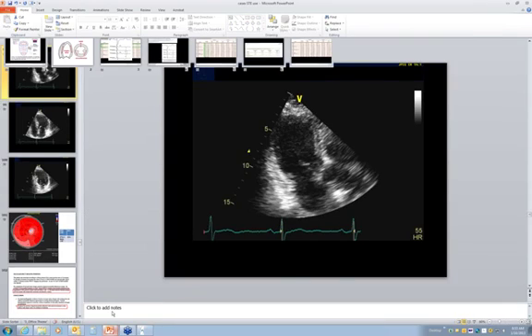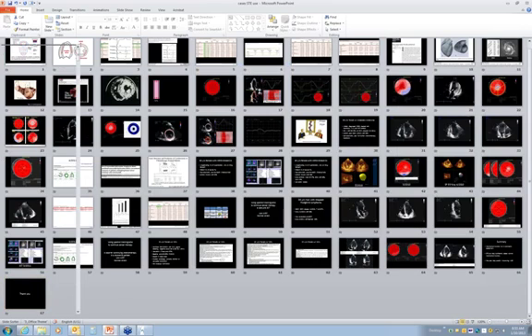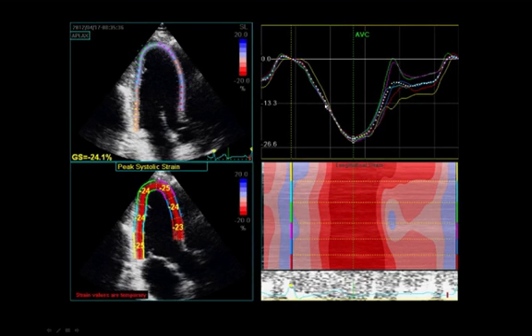And the other thing that I have noticed is on the normals, just like I showed on this first case, when I see a true normal, I have such a good line. They all together, all the segments, traveling together and lengthening together. In the Philips, I see those lines all over the place, and I just don't, I don't know, just my gut feeling. I don't like it when I see it. I just feel like I have to look away from the screen. Yeah, I think we agree.